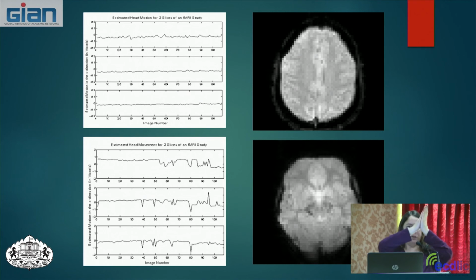So it might be looking at intensity changes in the border of the head and trying to minimize those by jiggling these time images around until that parameter is minimized. So it's sort of an optimization algorithm. And what we get then is motion estimates, and we get 6 dimensions of motion. We get the X, Y, and Z, and then we get the 3 rotation parameters.